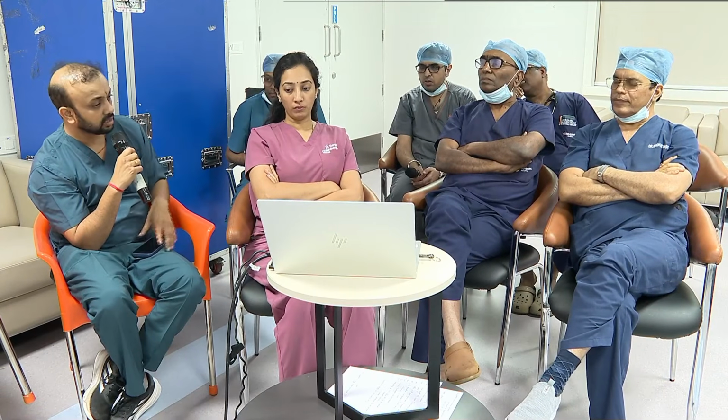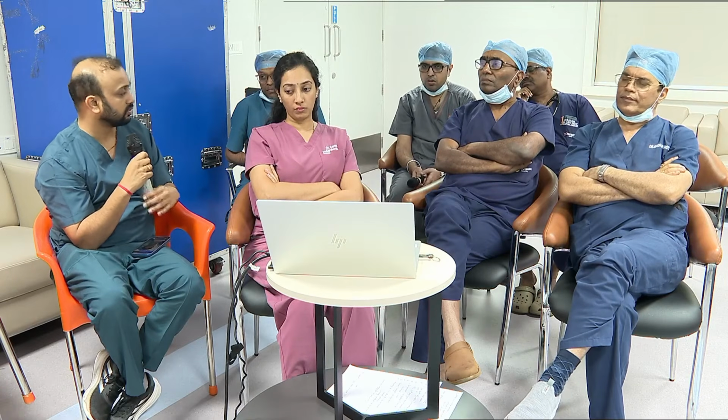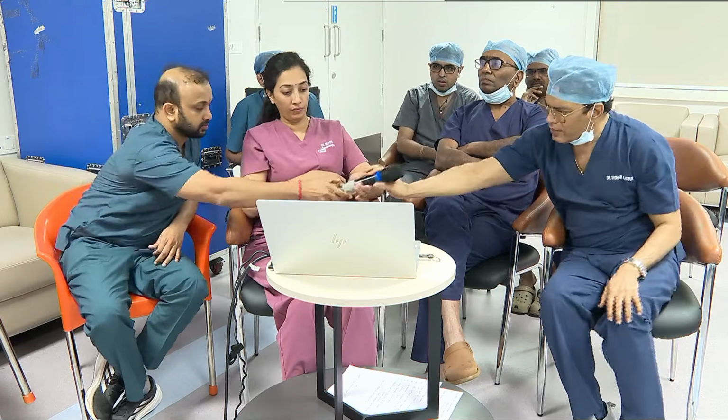For coronary, one cycle we deliver is 10 pulses given by the coronary balloon, and when we deliver one cycle of peripheral balloon, 30 pulses are delivered in one cycle. So we deliver 300 shocks for the patients in different cycles. That is how it is different from the coronary one. We are giving 6 mm, 7 mm and 8 mm.